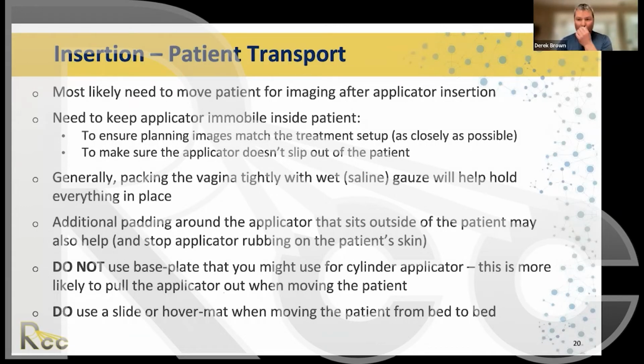Great. Dr. Brown, there's a question from Yvonne. They're asking how you would comment about patient preparation, full bladder, empty rectum, and what is preferred, and if there's any literature on it, if you don't mind sharing. So always empty rectum, just because a full rectum pushes the rectum into the area that we're trying to treat, and we don't want that. So as much as possible, empty rectum. That one's kind of definitive.